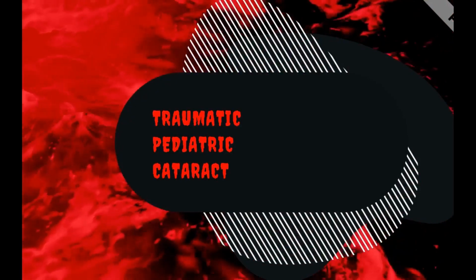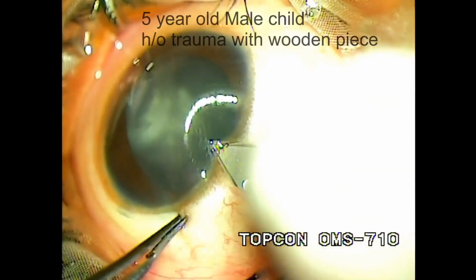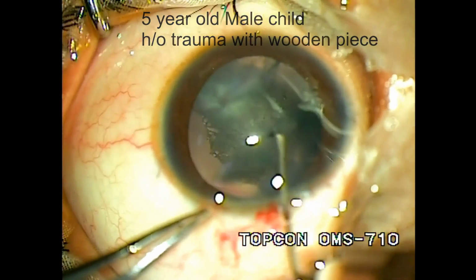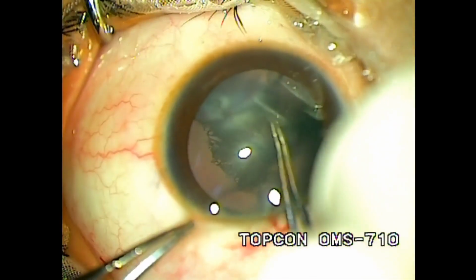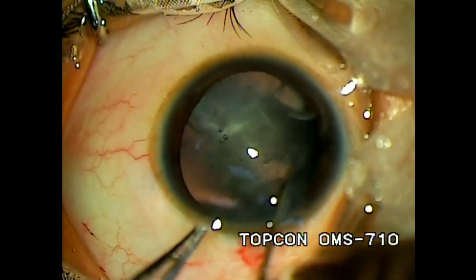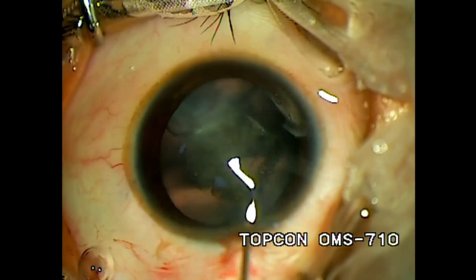We have a case of traumatic pediatric cataract, a 5-year-old boy with a history of injury to the eye with a wooden piece. Trauma accounts for 29% of all childhood cataracts. Classical blunt trauma forms a stellate or rosette cataract. In penetrating trauma, if the lens capsule is disrupted, it can lead to cortical opacification.